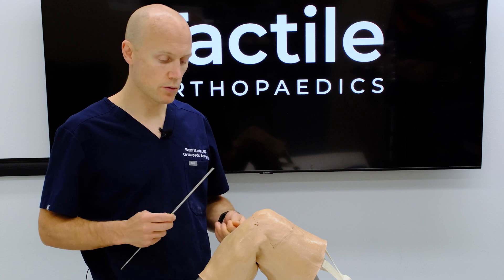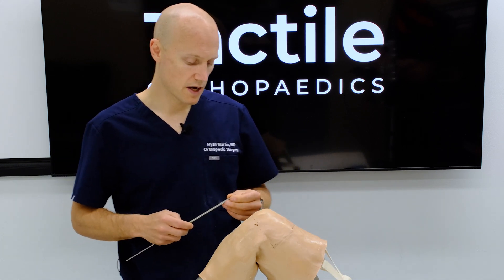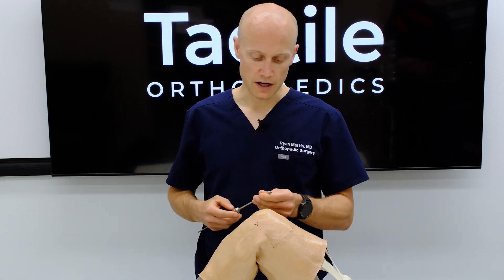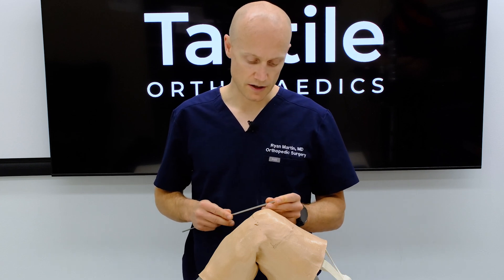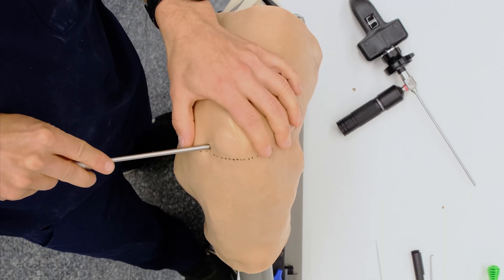Because we're scoping this dry, what we try to do is minimize the amount of debris that we get at the end of our scope. I do suggest that you enter the joint with either something within the cannula to replicate a trocar, or simply just the dry cannula.